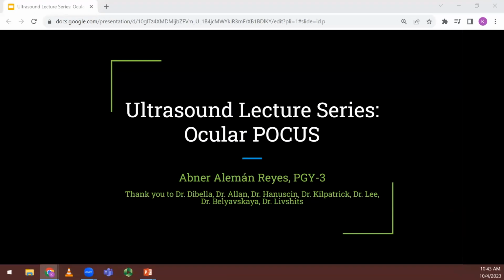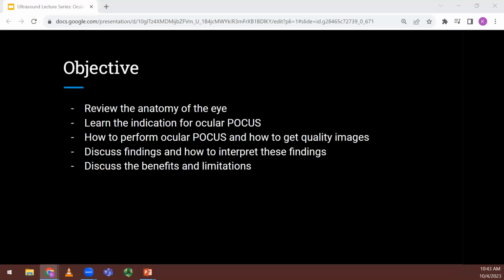So I'm Abner. We're going to continue on with ENT Ophthalmology Day. Now we're going to talk a little bit about ultrasound, ocular ultrasound. So we're going to review the anatomy of the eye. We're going to learn the indications of ocular ultrasound.